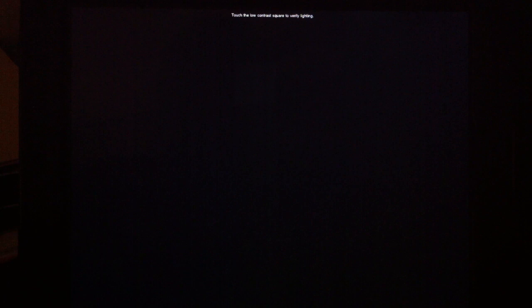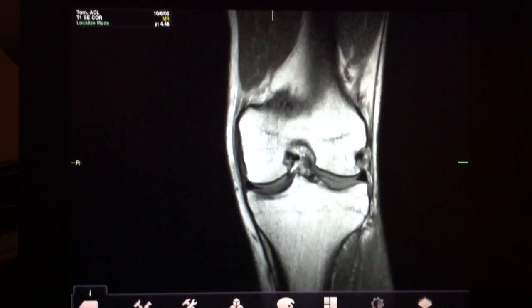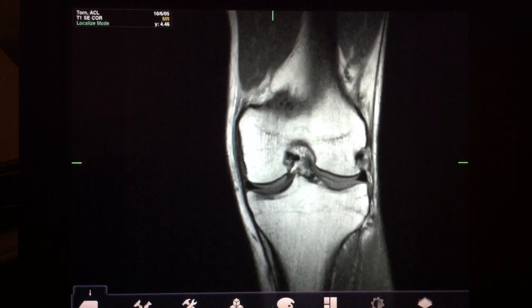It'll ask you to verify the lighting. This looks trivial, but if you look carefully, there's one very lightly shaded rectangle on the screen which you need to identify. And if you do, then you're reading it diagnostically, verifying that there's enough contrast to make this diagnostic.